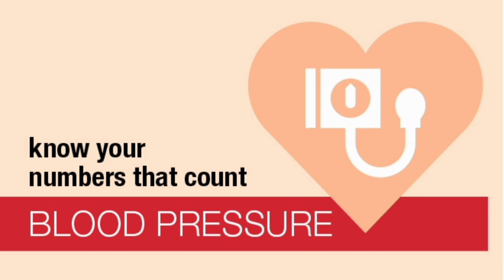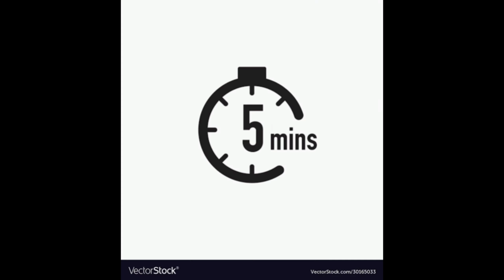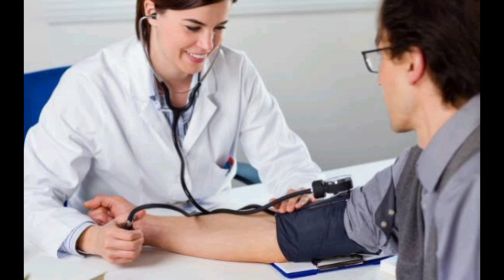Okay, now we will clearly discuss how to check the blood pressure with the BP apparatus. It's called a sphygmomanometer. Before checking the blood pressure, ask the patient to take a deep breath and relax for 5 to 10 minutes. Because if you check the BP immediately after walking or any other activity, it will show wrong readings, like high or low BP. So tell them to sit for a few minutes and then check the BP.